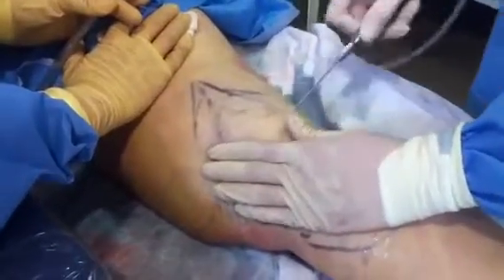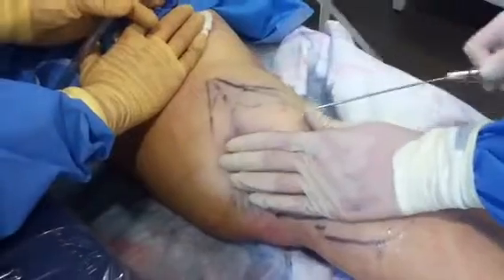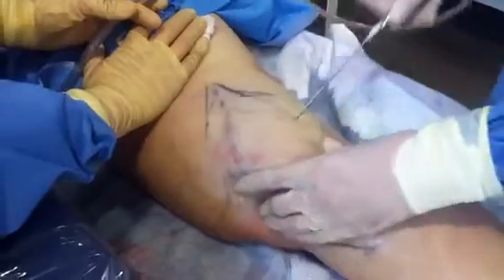The patient will see me back in one day for follow-up. And we're just going to continue to work on this area — I'm just making a fanning motion so there are no irregularities, just tapering along this area.